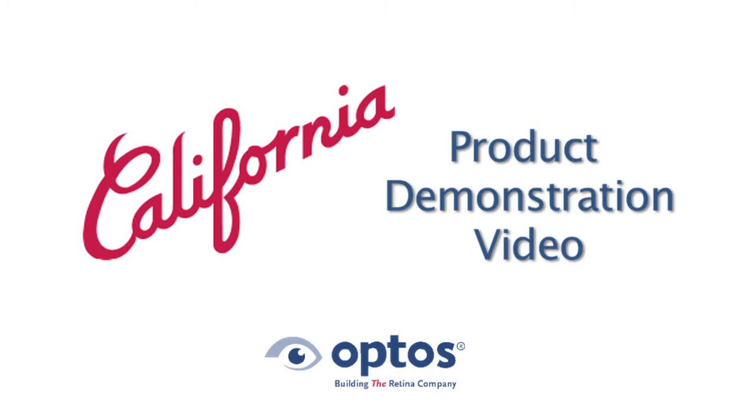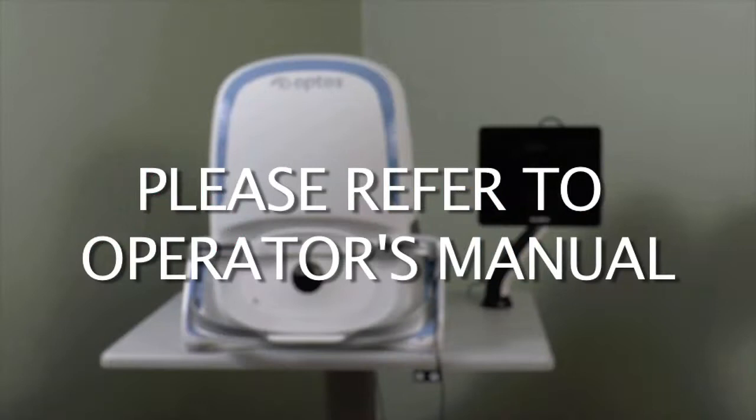Welcome to the Optos California product demonstration video, which provides an introductory overview on proper operation and imaging techniques. It is not intended to replace the initial on-site training or information provided by product documentation.